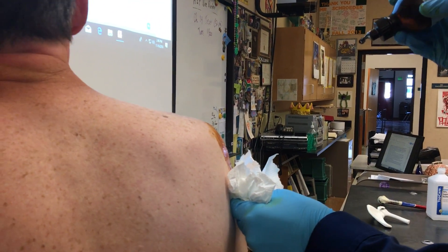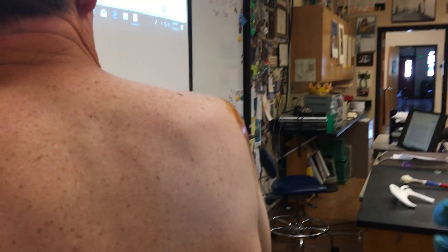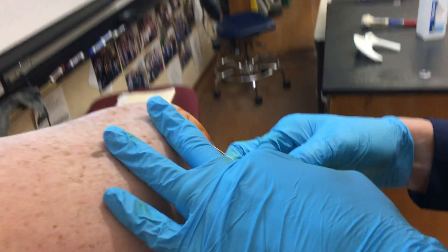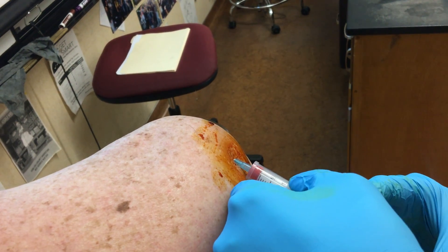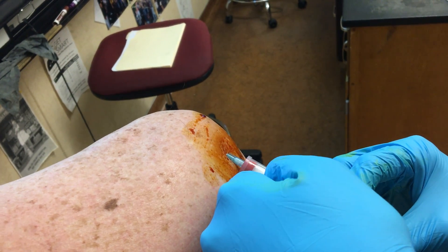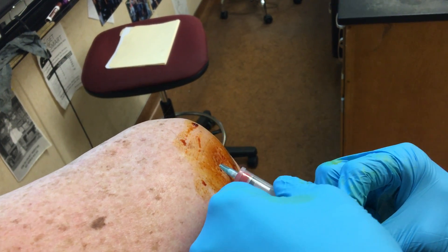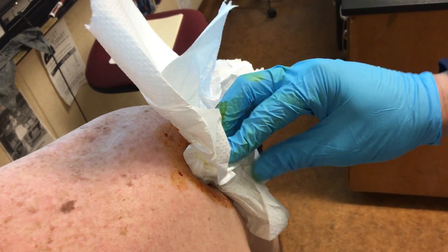We've got to go kind of quick before anything happens. I pulled back to make sure I wasn't in a vessel, and you can see the medicine is flowing very easily. That means I'm in that space I'm supposed to be, and I'm done. Really not that bad. How did that feel for you? There's a little bit of a pressure feeling.